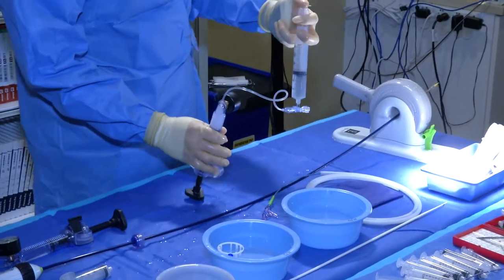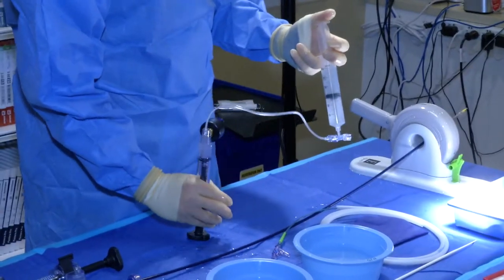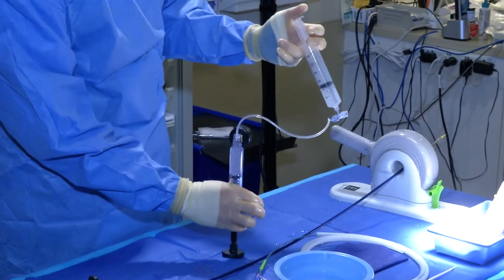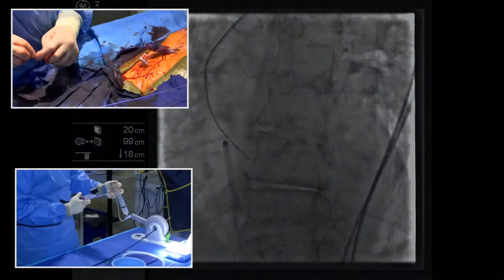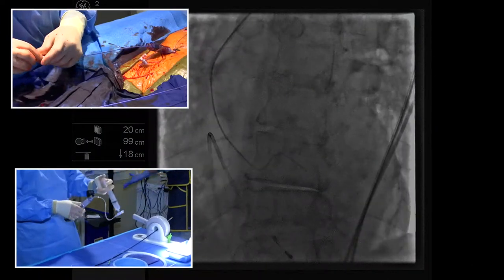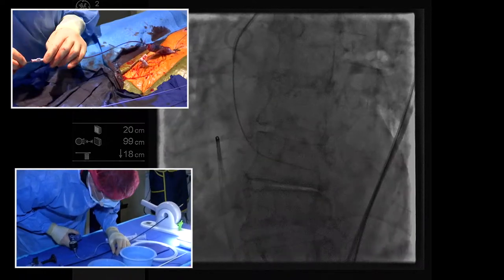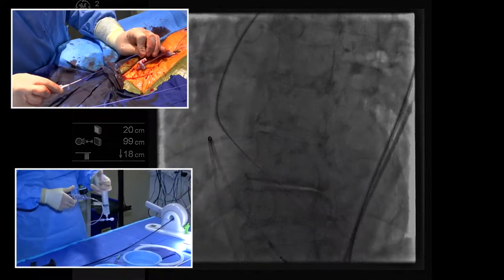I'm still working away here. This is hard. Look how tight that is. That's very tight. So that's not quite in far enough to track it. I'm straightening it out, trying to get the wire in a little further. Now I've got the wire in. Now it's slicing down that valve.